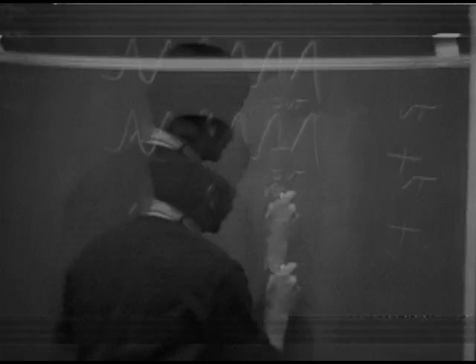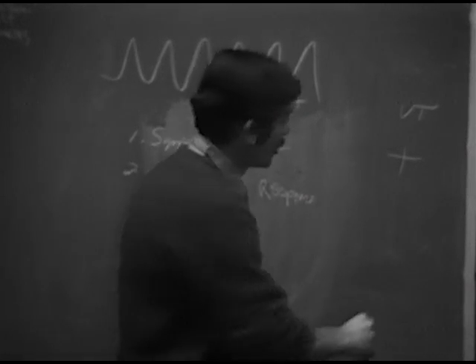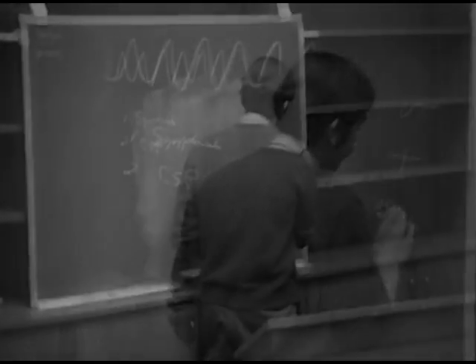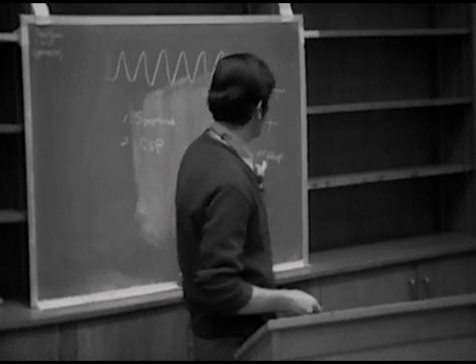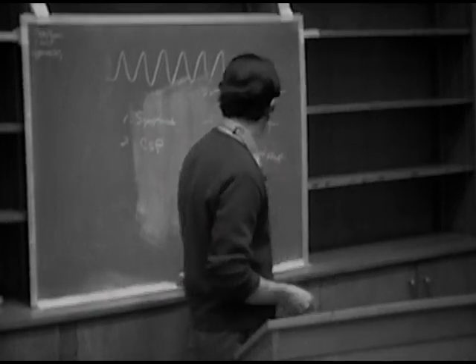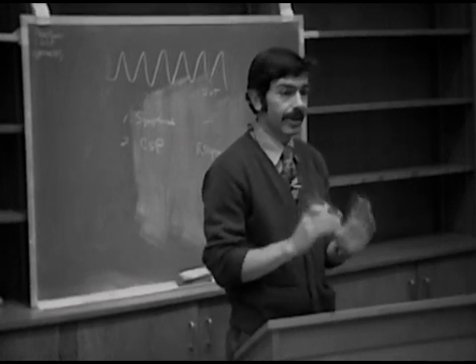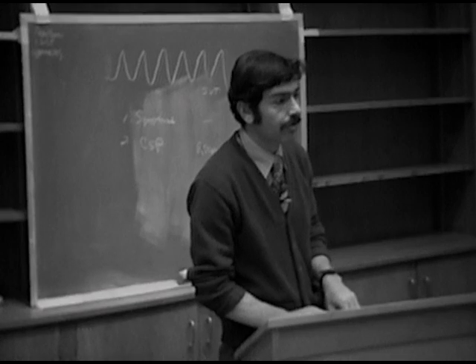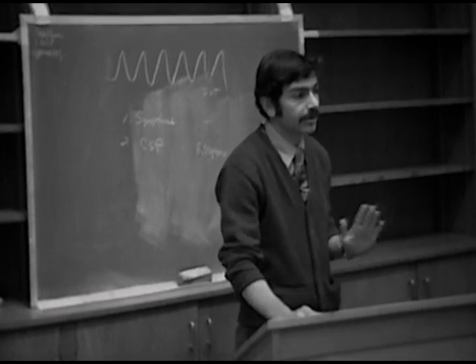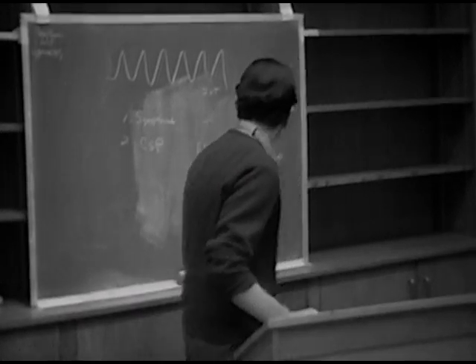So here you have a response, and here you have no response. But just because you have no response, that does not mean you do not have a supraventricular tachycardia. In other words, this is only a helpful thing if you actually get a response. Because as you all know, in patients with PAT, some of them respond to carotid sinus pressure and some of them don't. So this is helpful if you do see a response.